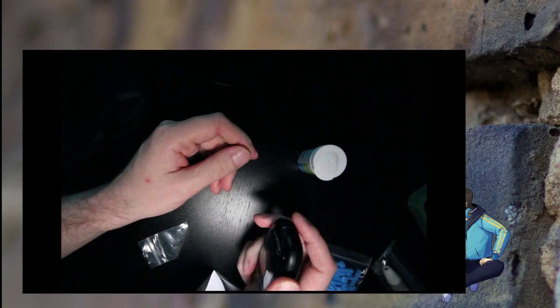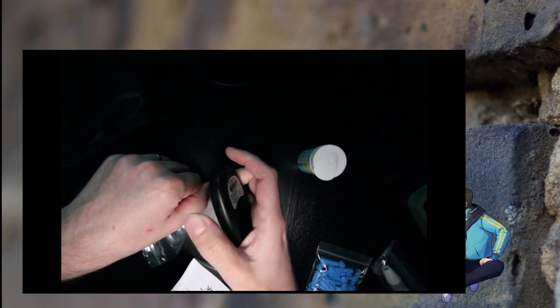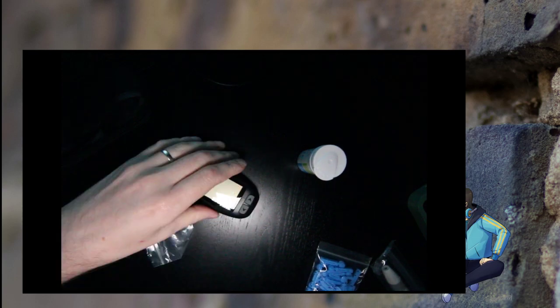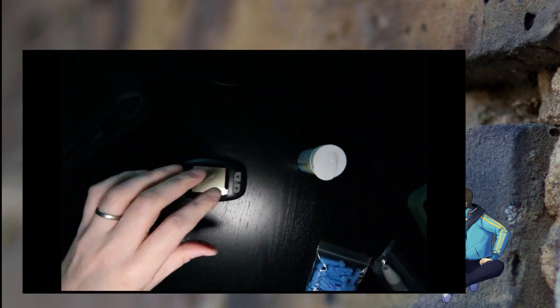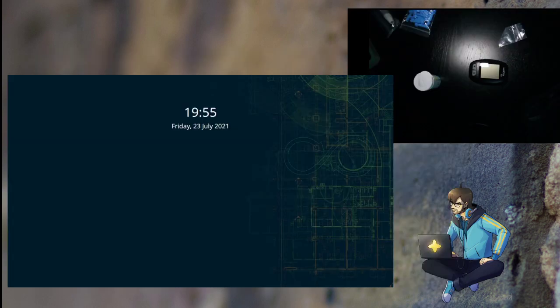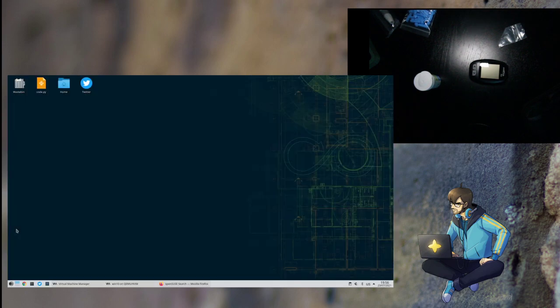Oh, and like many other Chinese meters, this one does have this slider here to kick out the strip. Now, before I break my fingers off camera to just check the blood sugar, I want to try to figure out for a moment what the heck this device is even going to be. Because it has a micro USB plug, which means it doesn't need an external serial adapter. It has probably a built-in UART adapter. So what I'm going to do is, I'm going to check, oh, unlocking failed, sorry. I'm going to check when I connect it.